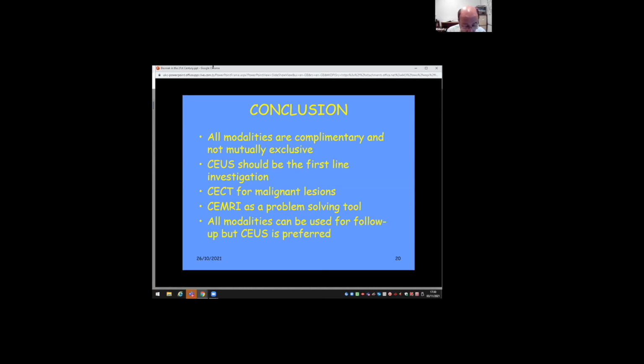Ultrasound said, no, it wasn't simple, it was a 2F. MDT suggested another CT to sort out the first CT. For goodness sake, which is wrong. That wouldn't happen now. There's no way that a triple phase CT will undo ultrasound in looking inside a fluid containing area.